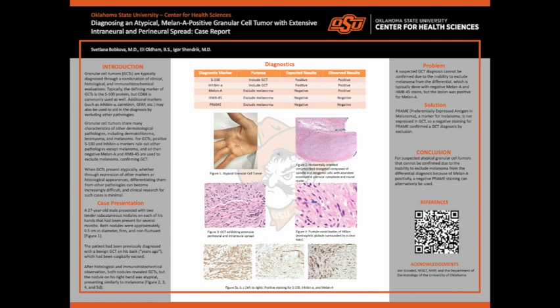This first one, this table, shows the diagnostic marker, the purpose, expected results, and observed results. So after confirmation of the first one as a GCT, it was presumed that the second one was also a GCT. And so usual confirmation that includes GCTs, the S100 and the inhibin A. And so there's the purpose, that was the expected results, and that was the observed results. And so it went as expected.